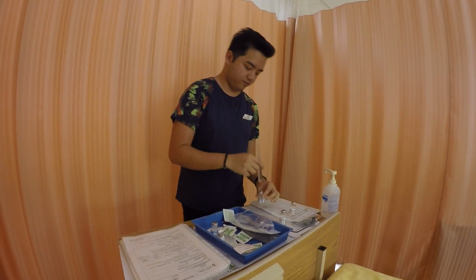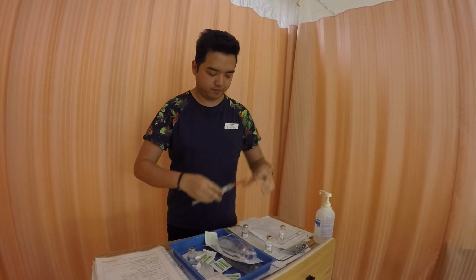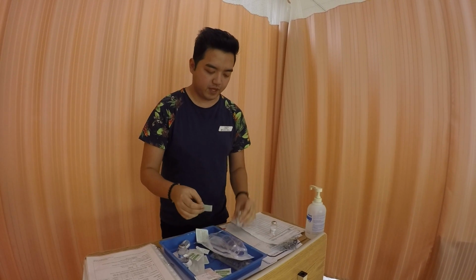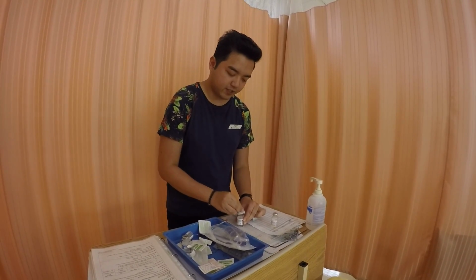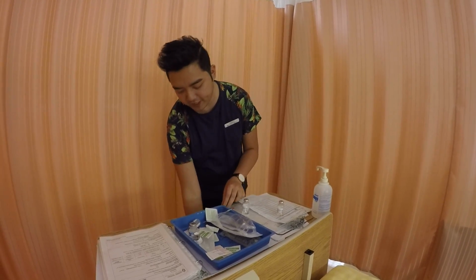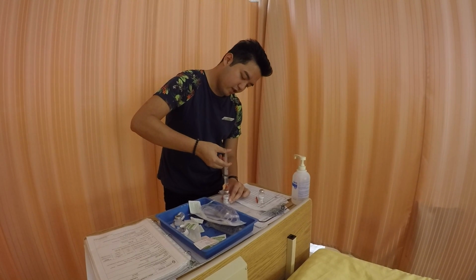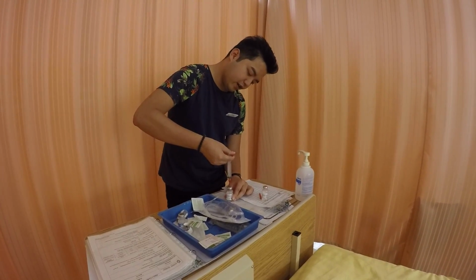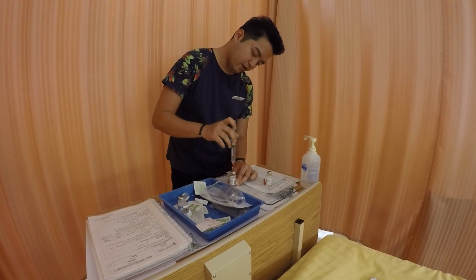Okay, there you go, so we have 10 ml. Then same thing, clean the opening of the cefoxitin for 30 seconds, let it dry for 15. Inject the sterile water, and allow the plunger to go back on its own. Okay, there you go.